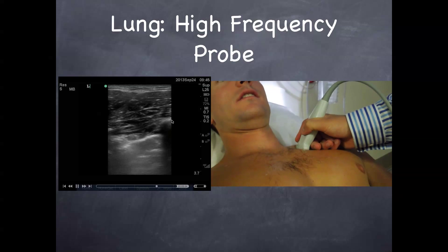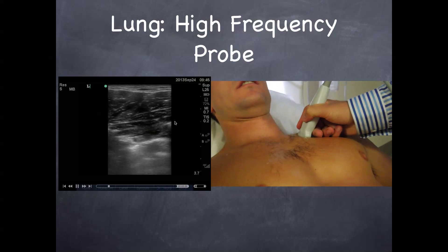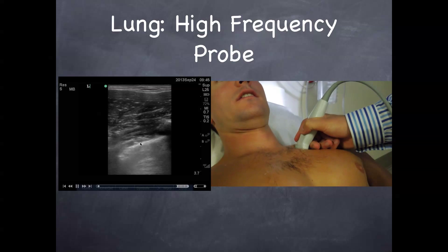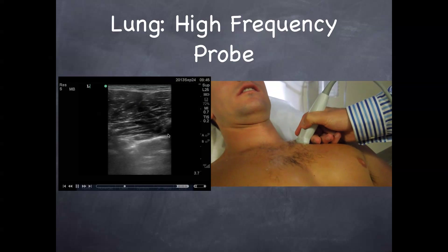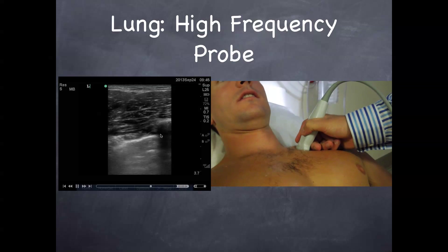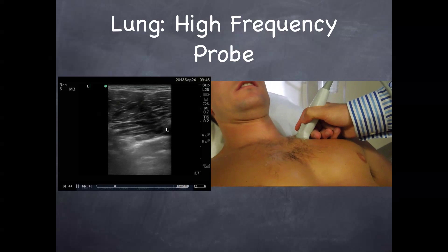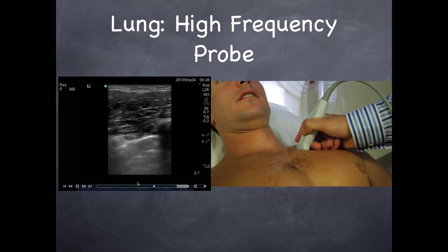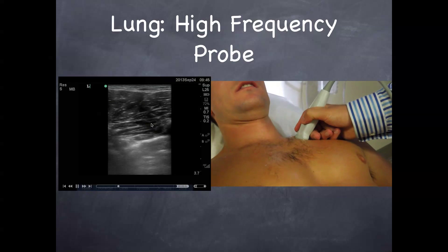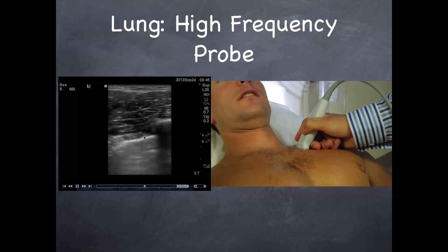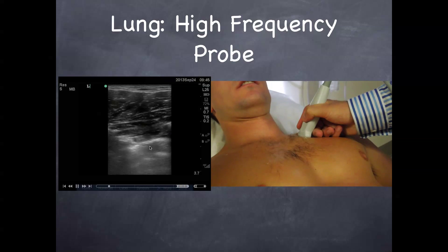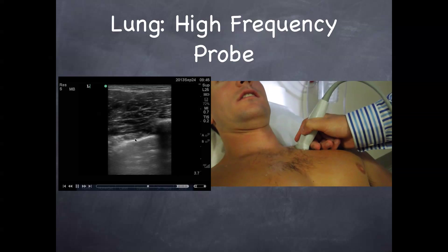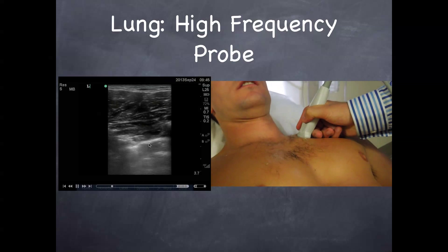On the left is the corresponding image with the ribs and rib shadows. They call this the bat sign — B-A-T — because it looks like a flying bat. Right away you can see they're sliding. You can do M mode if you want, but you don't necessarily need to. You can safely see the sliding here. One trick to improve this is to turn up your gain — it helps see the sliding of lungs.